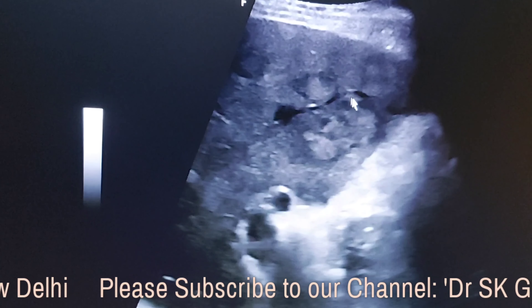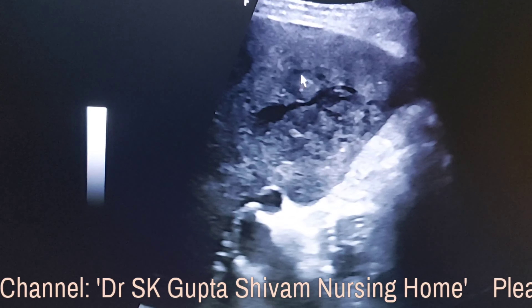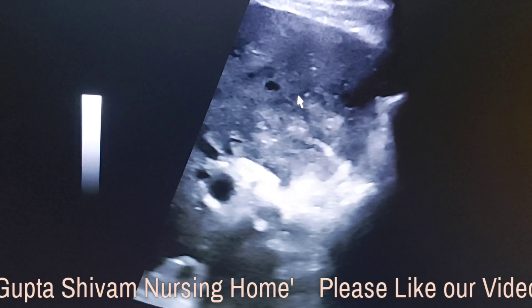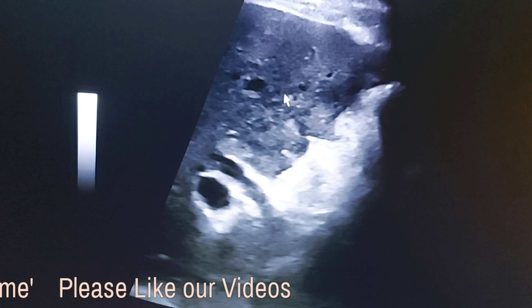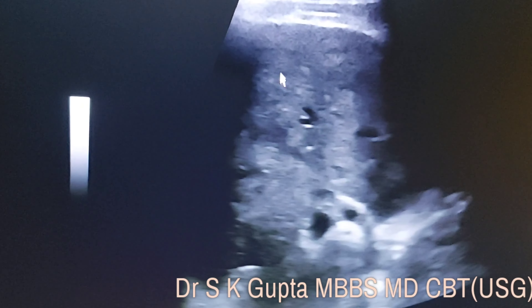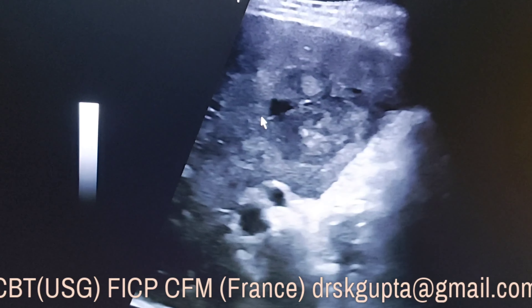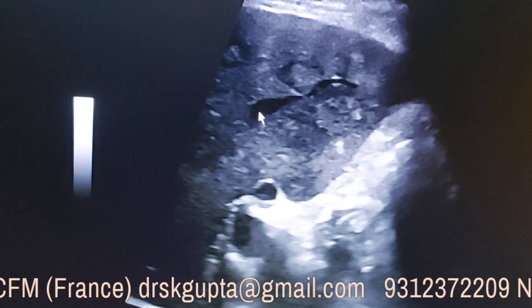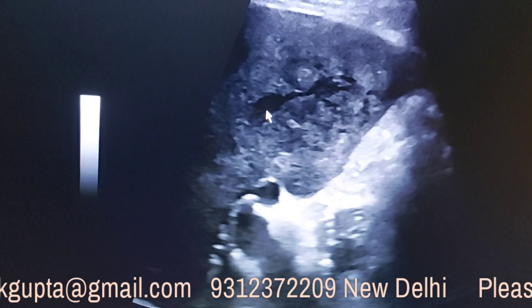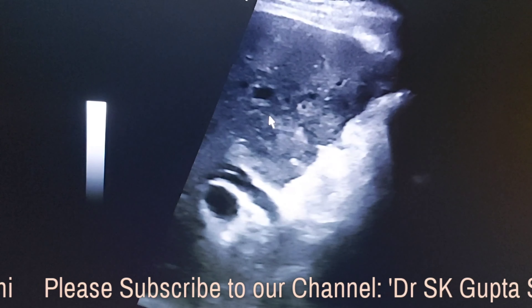These are nothing but the secondaries and there are multiple of them; they are 1 to 2 centimeters in size. This is one of them and they seem to be distorting the blood vessels, causing a mass effect. We are dealing with a case of multiple secondaries of the liver. In the right lobe you can see multiple hyperechoic lesions surrounded by a peripheral hypoechoic rim, which is a classical sign of secondaries of the liver.